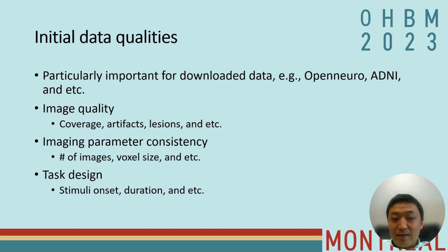And for task fMRI, you also need to check the task design to see whether it is consistent across individuals. For example, the stimulus onset or the durations of blocks may vary across different subjects.